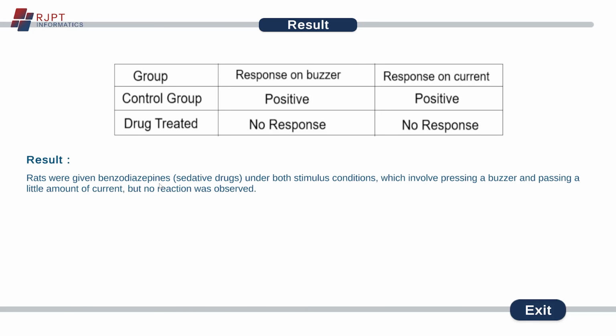So now we have come to the end of this video. I hope that you have learned a lot about this experiment, about the Cook's pole climbing apparatus, and about the effect of the benzodiazepine on the animals.